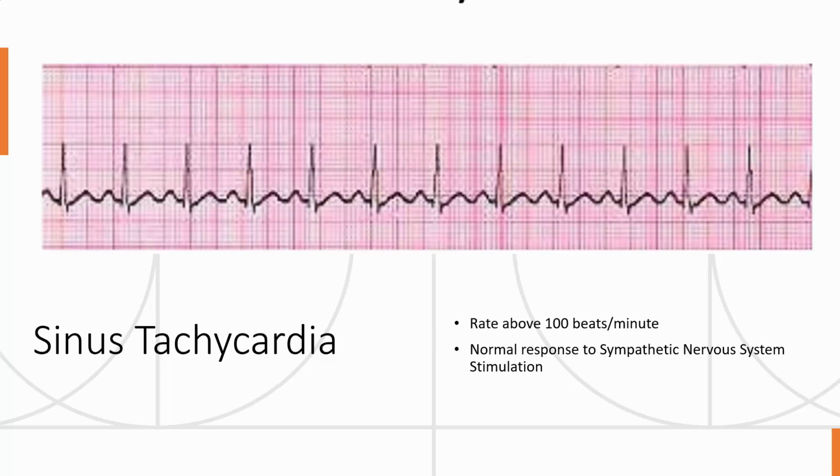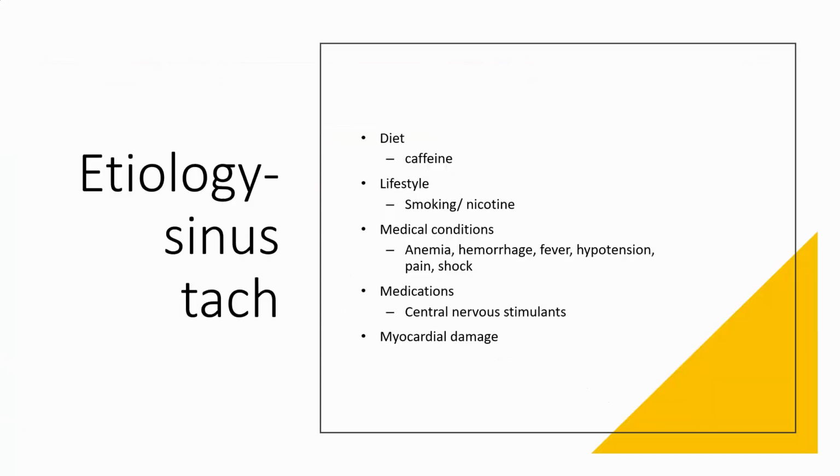So when you think about sinus tach, one thing you have to look at is, what is that person doing? As I told you right here, it is a normal response. Sometimes it depends. Is it a normal response to activity? Is this person exercising? What's going on with this person? Are they trying to walk up some stairs? That's one of the first things we're going to look at there.